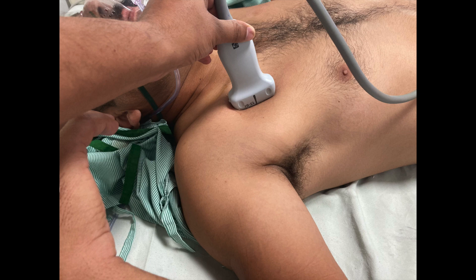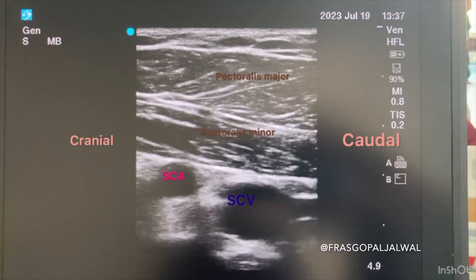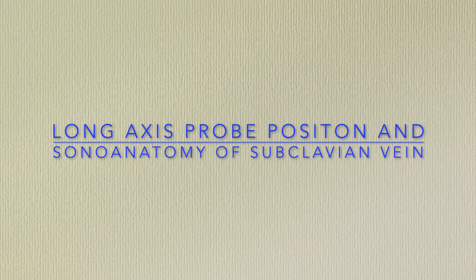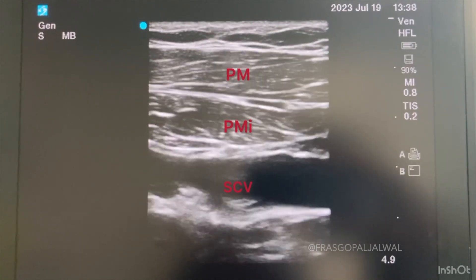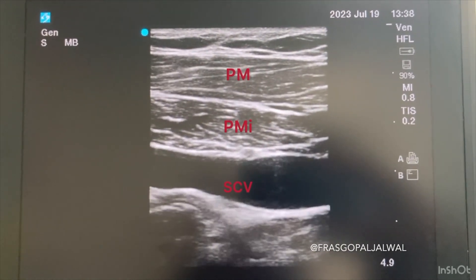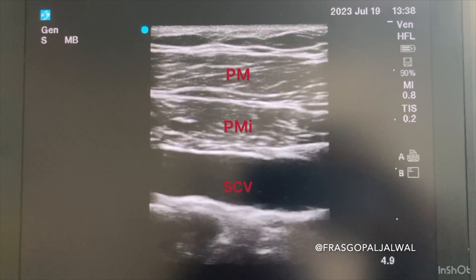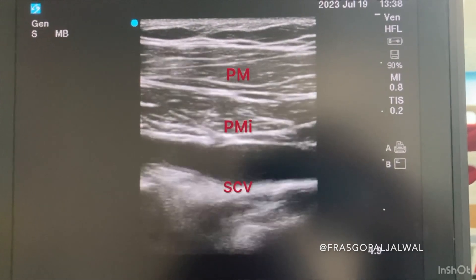When you place the high-frequency linear probe in a parasagittal plane just below the lateral one-third of the clavicle, you will see a short axis view of the subclavian vein and artery. The subclavian artery can be identified by its pulsation. When you move your probe toward the axilla, you will see a long axis view of the subclavian vein — the vein will be compressible, and just like a road, some portions will be broad and some narrow, as you can see here with compression.